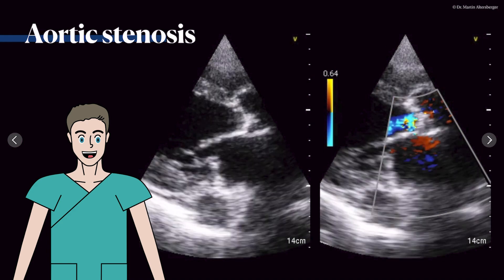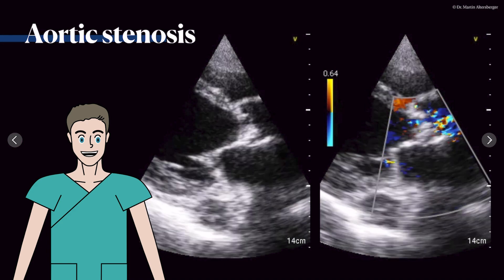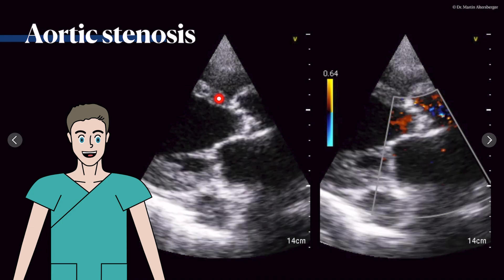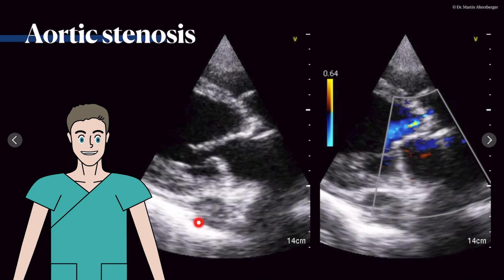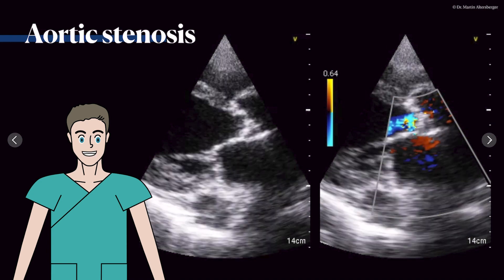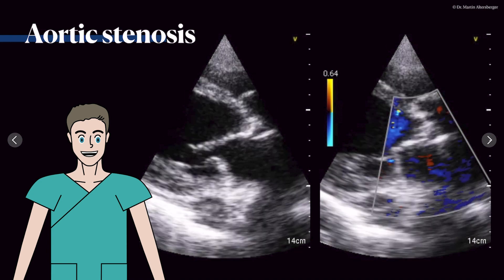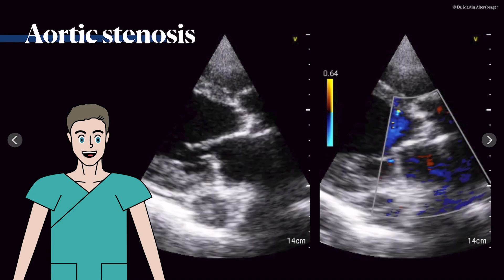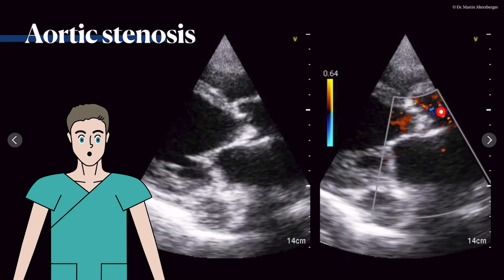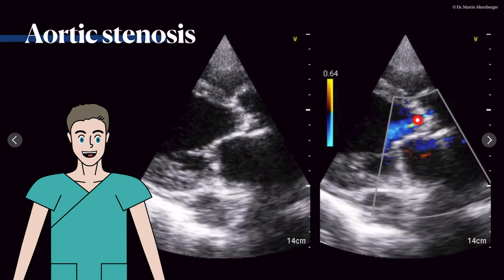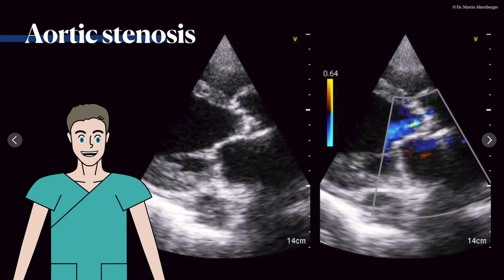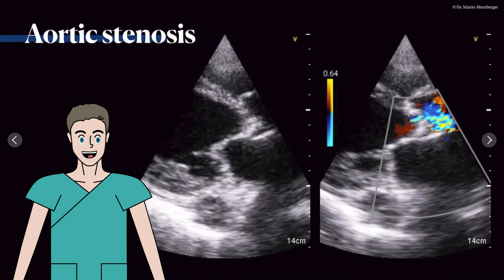We take a point-of-care ultrasound device and image a parasternal long axis view, with and without color Doppler. We can appreciate the right ventricle, the interventricular septum, the inferolateral wall, the descending aorta, the mitral valve with its anterior and posterior leaflets. In the center of the image is the aortic valve, which is severely calcified. When you add color Doppler, you see turbulent flow and also a little aortic regurgitation. The area where the valve opening should occur shows very turbulent flow, also after the stenotic part.